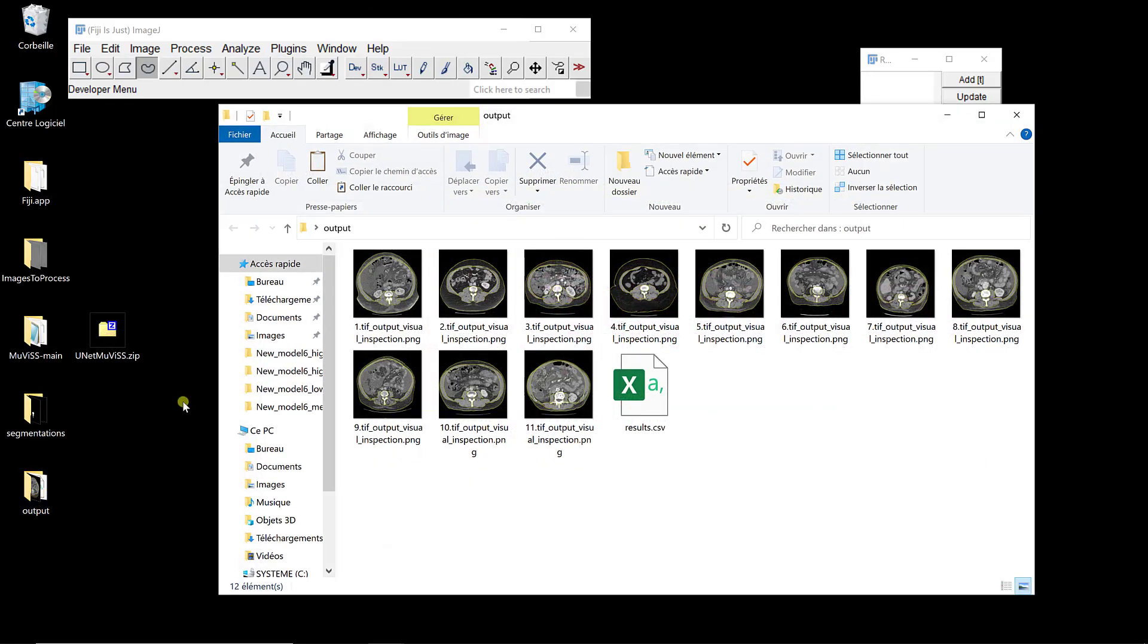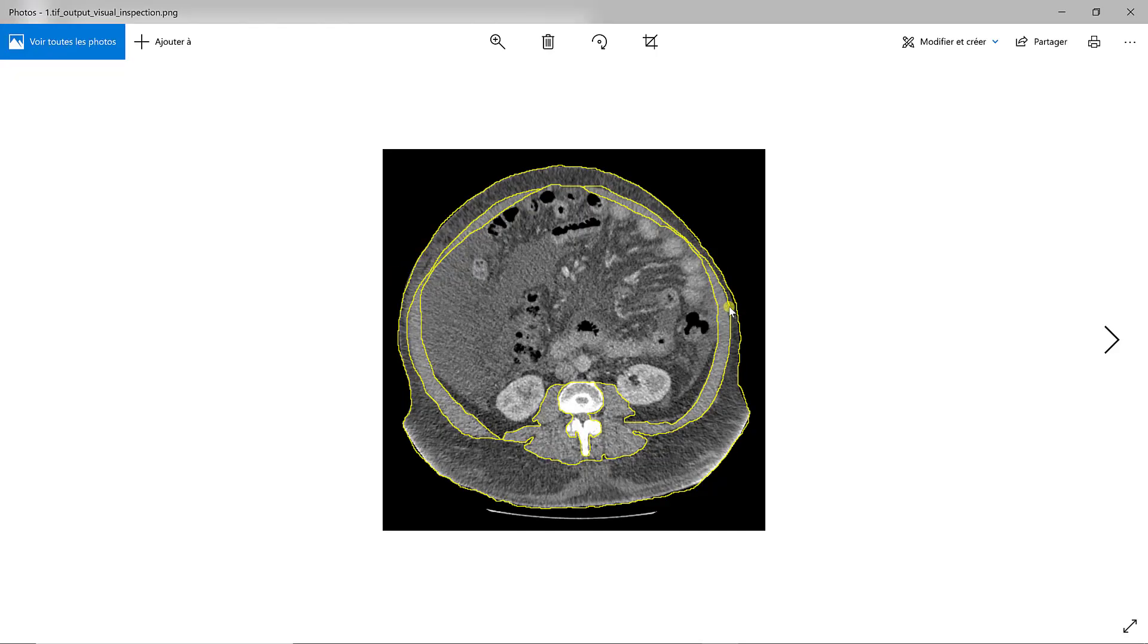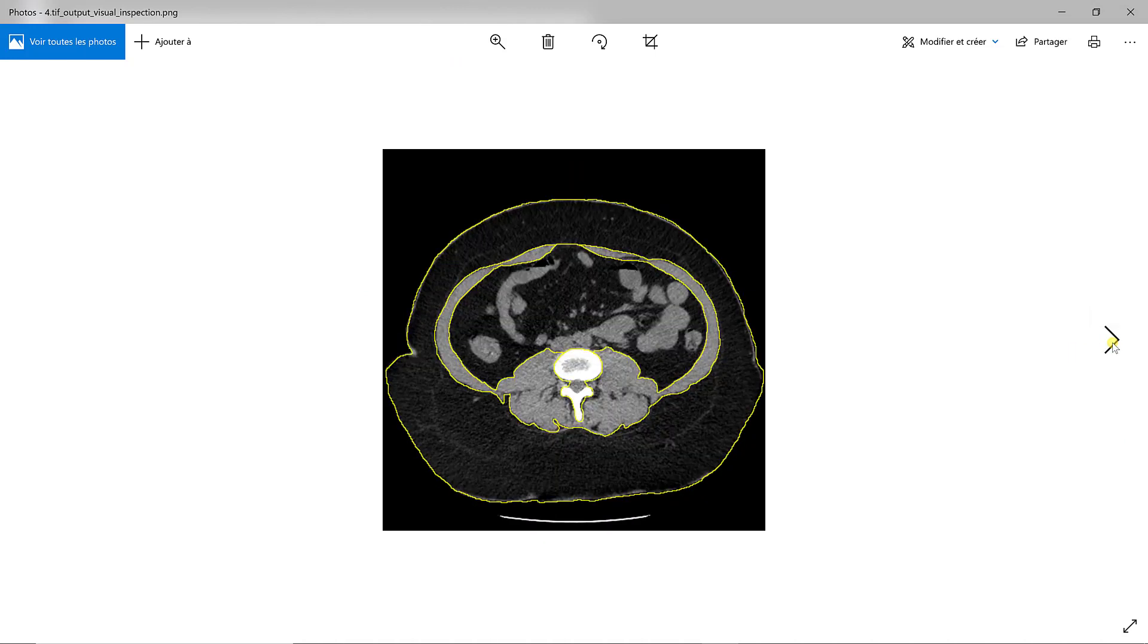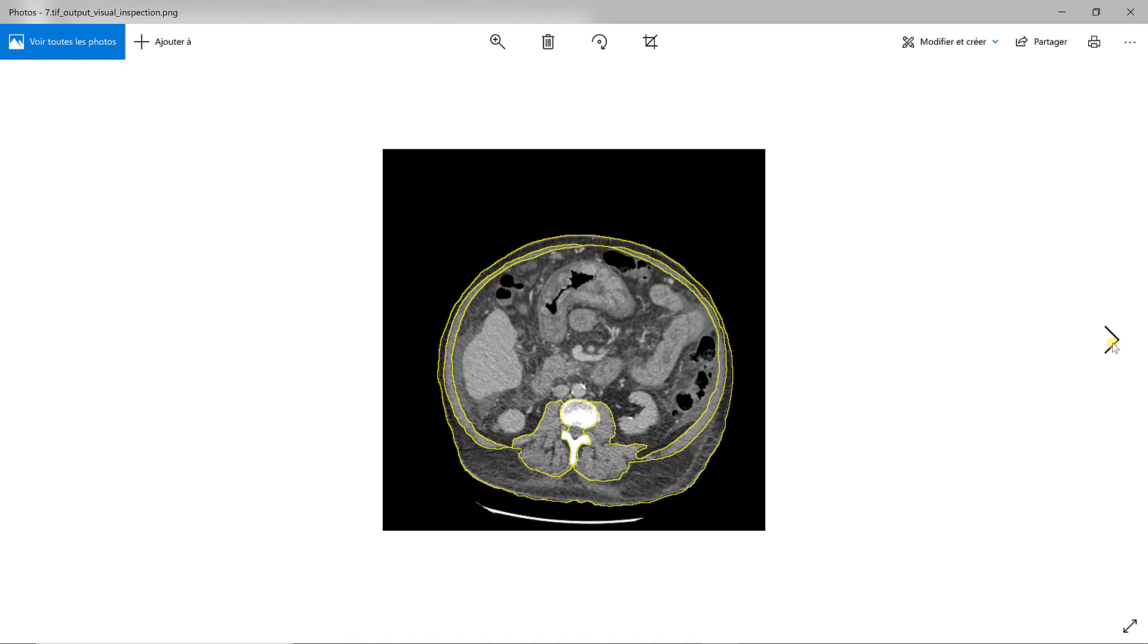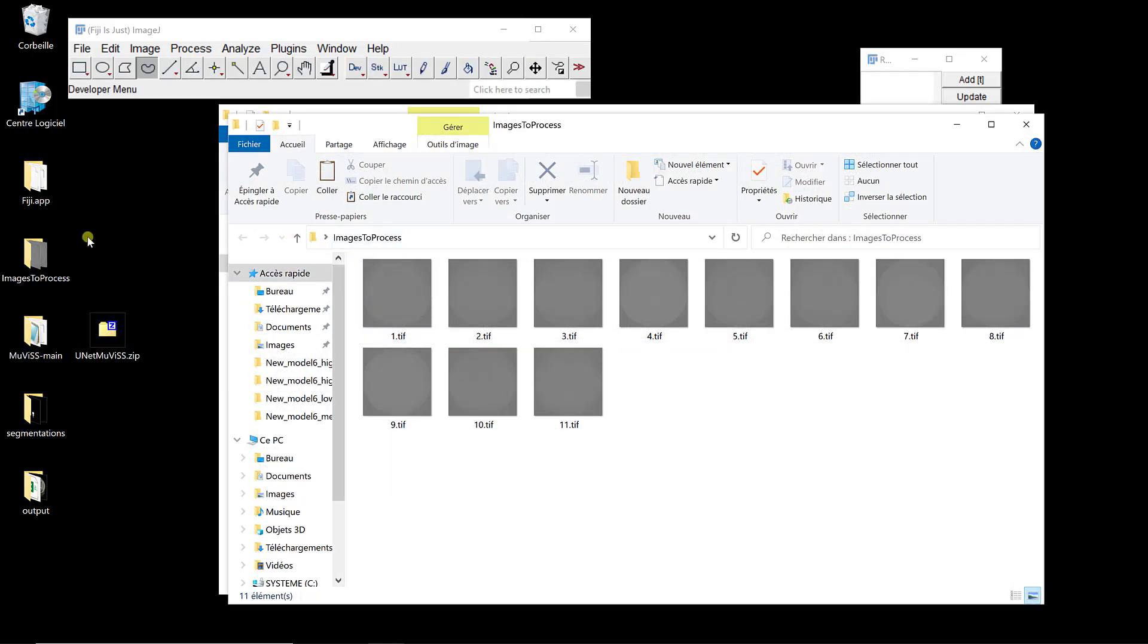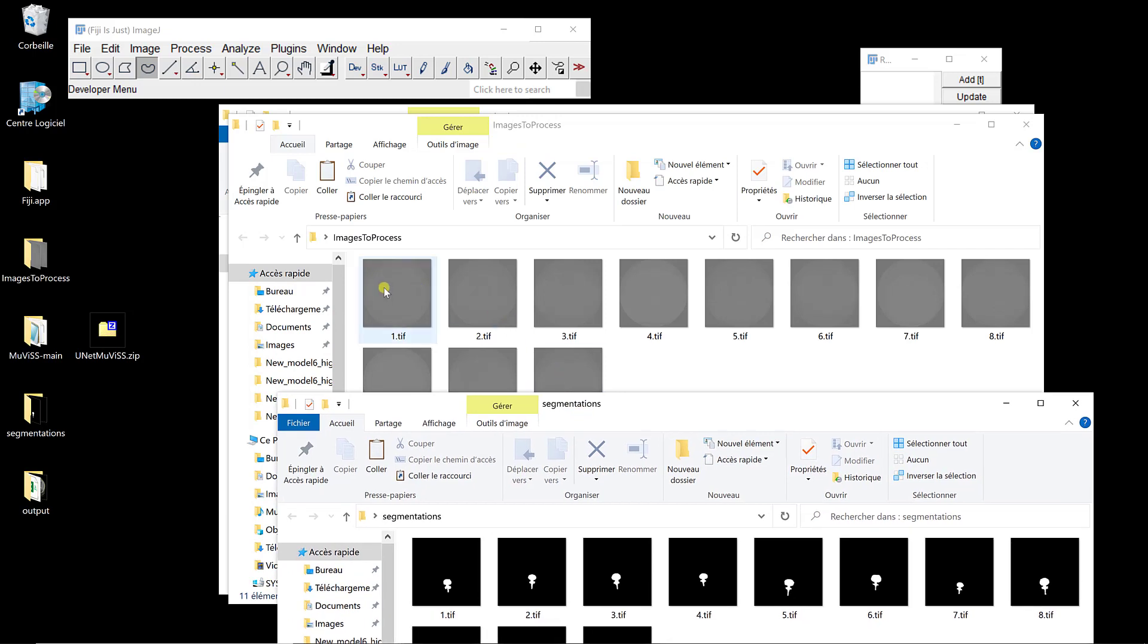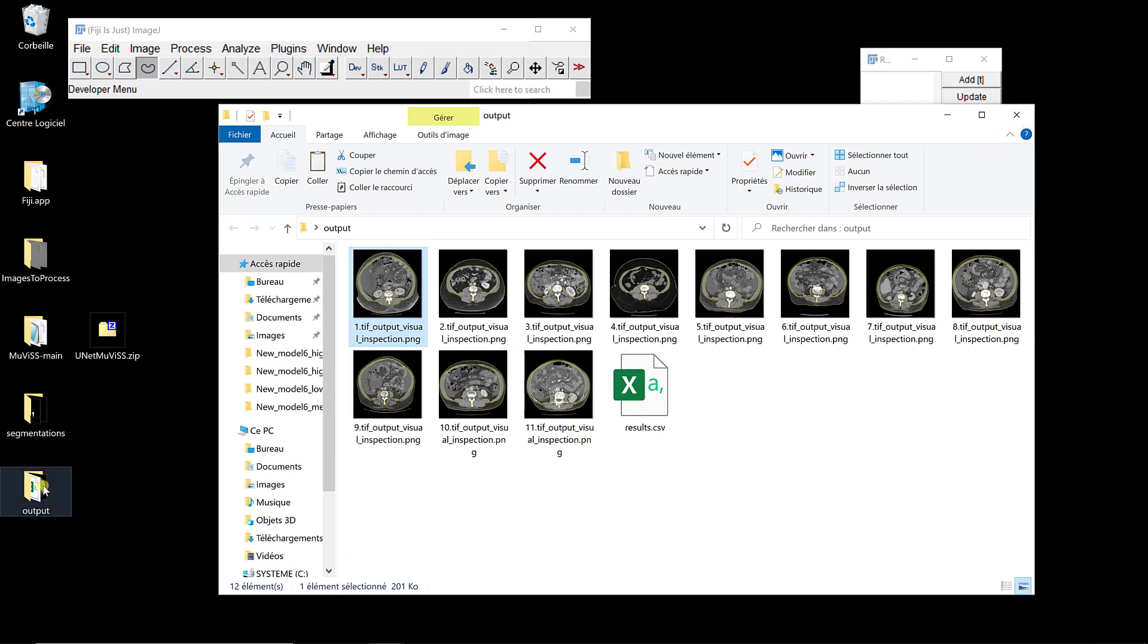And in my output directory, as before, I have a visual inspection to show the segmentation on top of the input image. So probably you don't really need that because you did it before you define the segmentation, just to make sure that it actually had the correct segmentation for the image. That's something I didn't specify. But to make it work, you need to have the same name for images in the folder for images than for segmentation. So you see here 1.tiff with the corresponding 1.tiff segmentation.